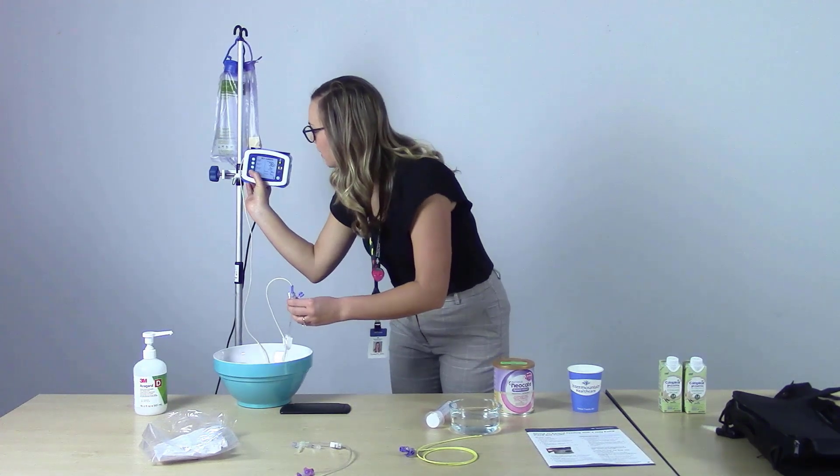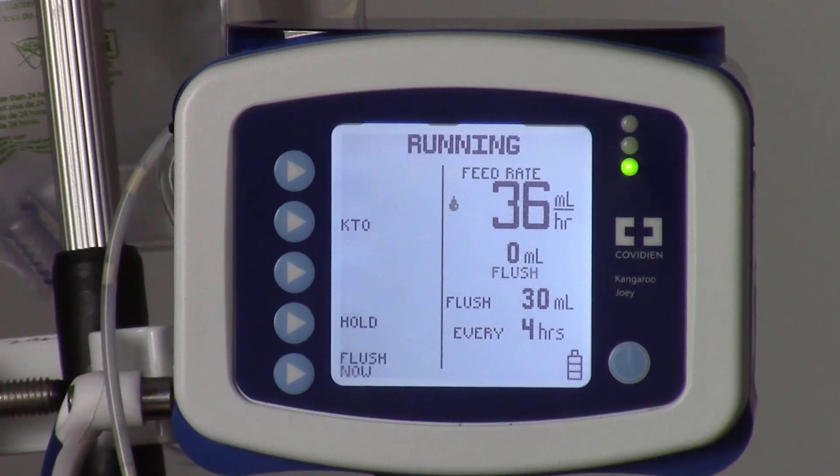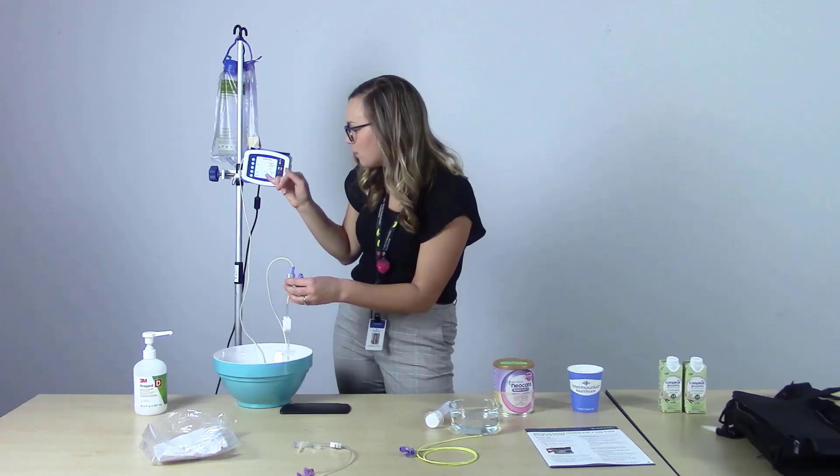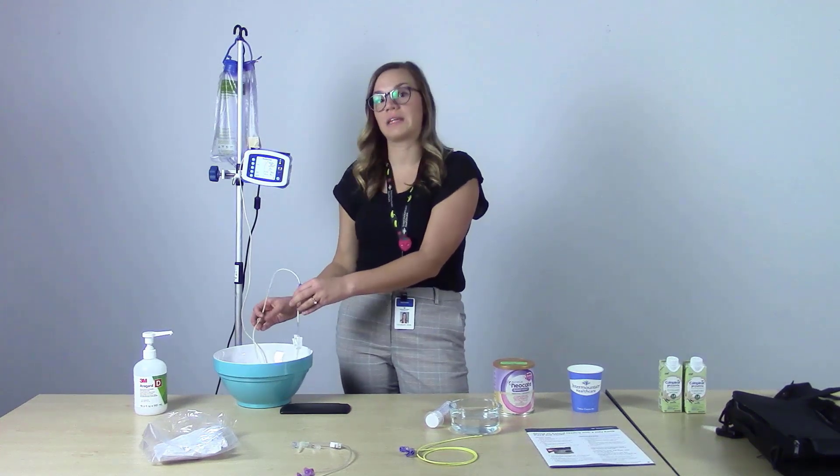We're all good to go — press run. We can hear the rotor start to turn in the pump. On the screen it tells us 'running,' and we can see a black teardrop dripping down by the feed rate. This lets us know that the pump is running and we are administering a feeding.